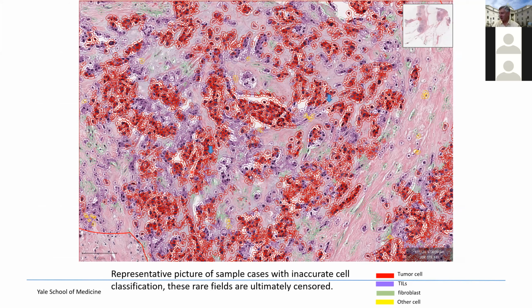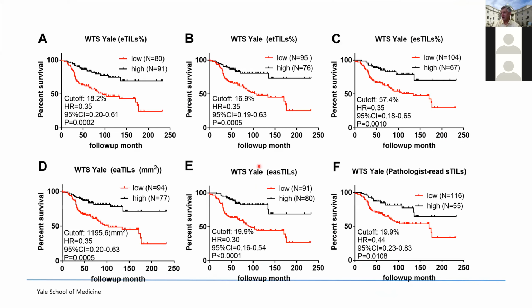And this is just considered an AI failure. And artificial intelligence sometimes fails, and that's when we need real intelligence and real pathologists to sort of censor those cases. This happens in our experience less than 1 in 100 times. So it's not that prevalent and still can be used as a clinical test, but an important part of the clinical test has to be pathologist review for AI failure. And so here's how we did when we looked at the validation or the training sets.